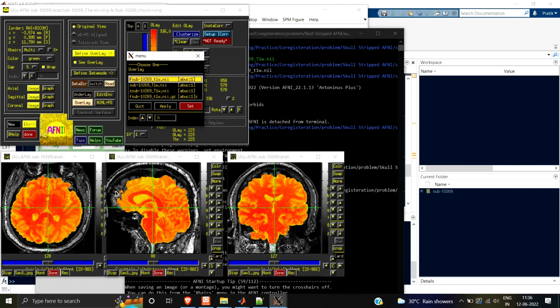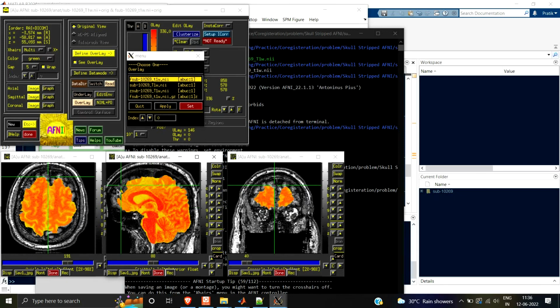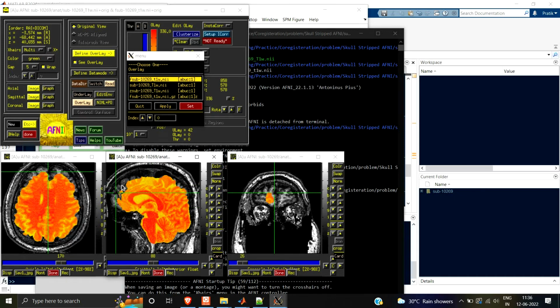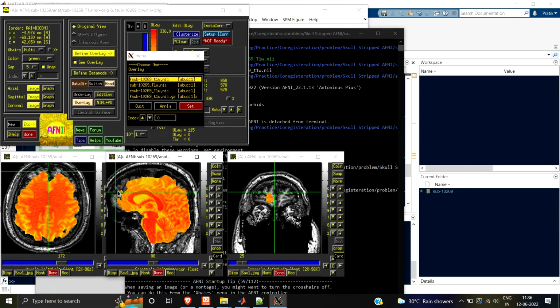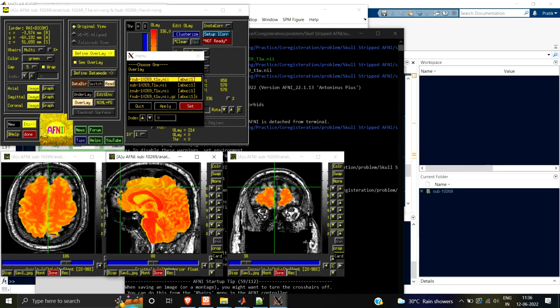You can see that there are some parts over here which are not exactly taken out. So this part is remaining. FSL has just taken this part. It has cut out this brain portion. You can see that over here also. This much is the brain, but FSL just took this much.